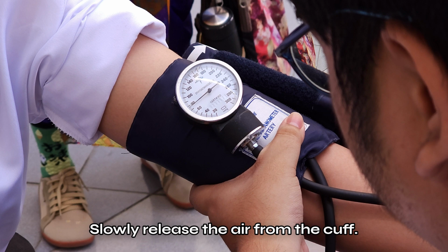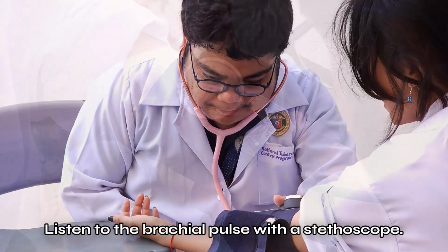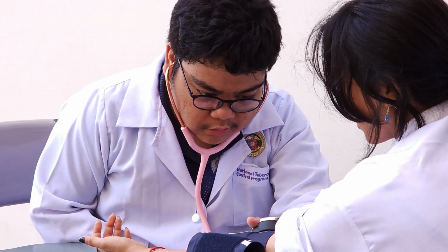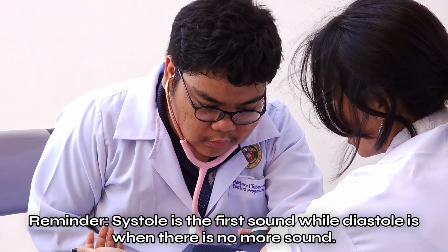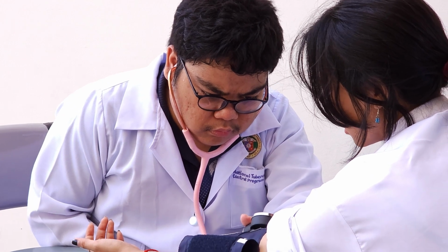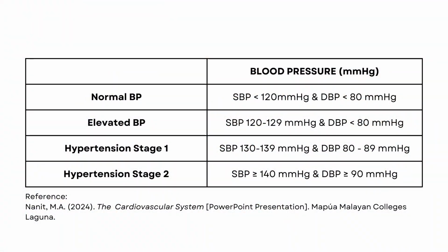Slowly release air from the cuff and listen with a stethoscope placed over the brachial artery. Note that the value for systolic pressure is when the first sound is heard, and the value for the diastolic pressure is when the sound disappears. Record the blood pressure.